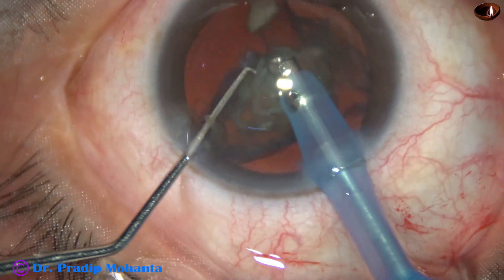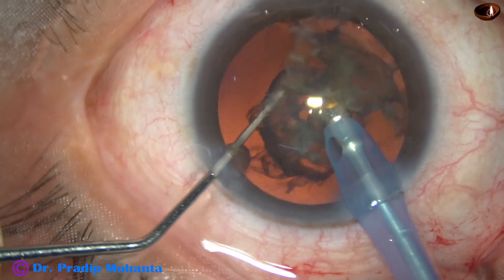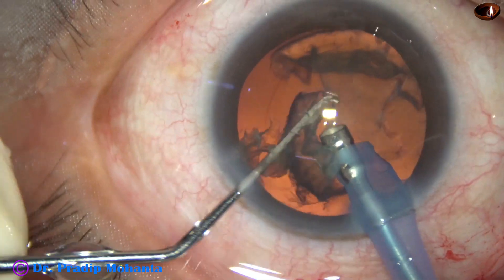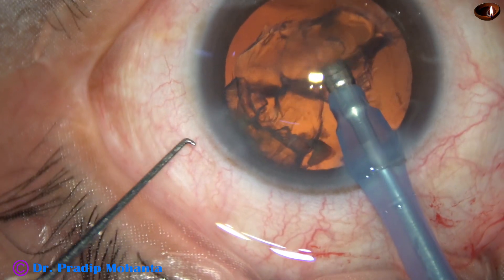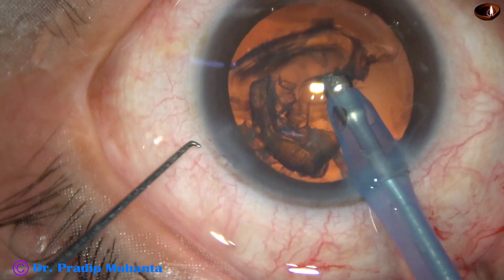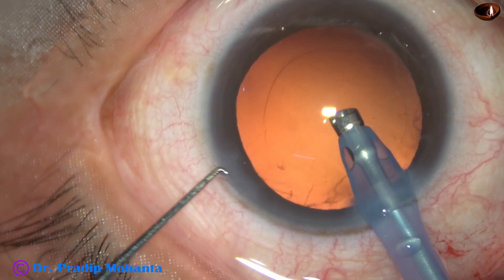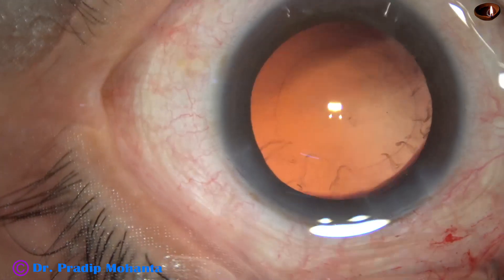During emulsification of the last piece, the parameters are reduced: flow rate is 25 ml per minute and vacuum is 250 mmHg. In this case we have very little cortex, only some fibers here and there.